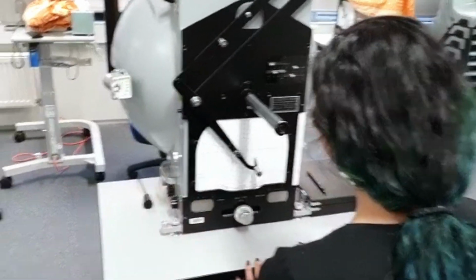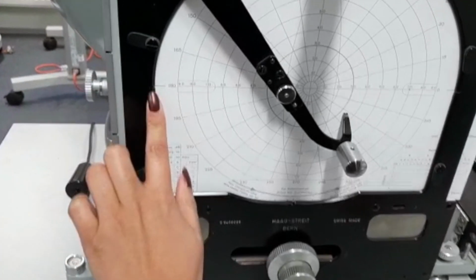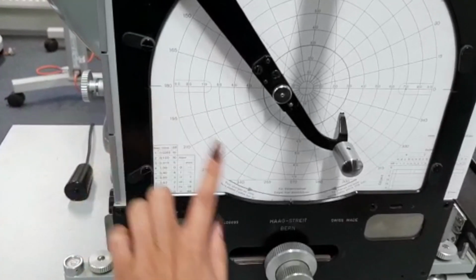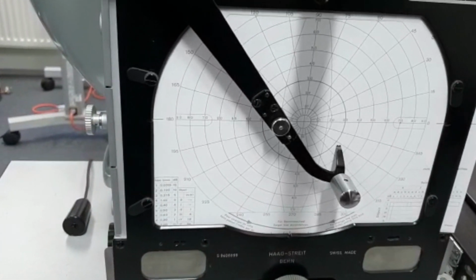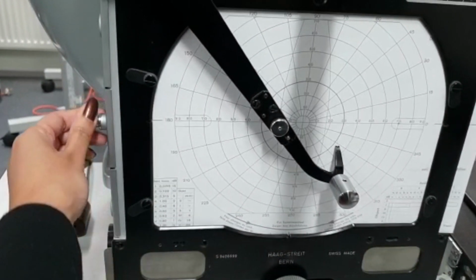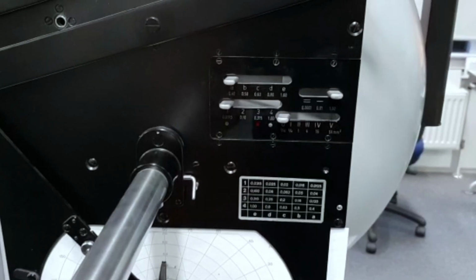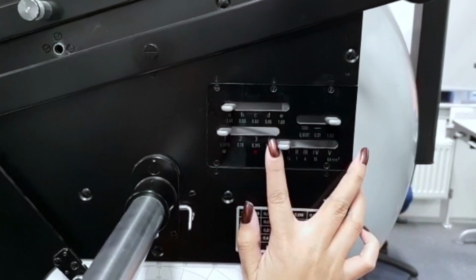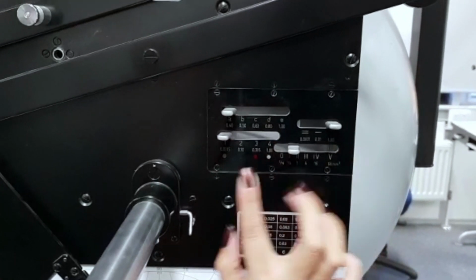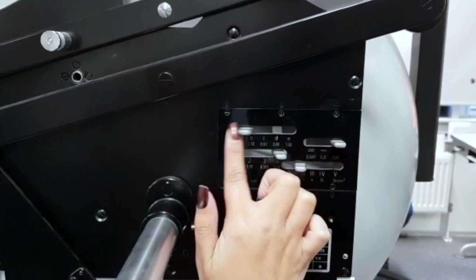Make sure that the horizontal line on the recording chart matches with the horizontal notch on our chart, and the same with the vertical. Tighten the recording sheet in place so that when you are recording, it does not move along. Change the light stimulus by moving the dial to Roman numeral 1 for the smaller size, to number 4 for the brightest light, and changing it onto E.